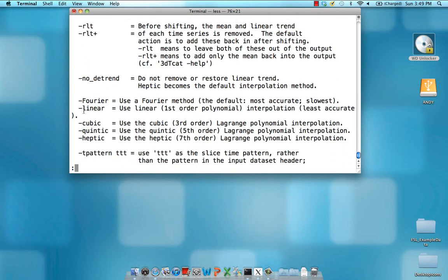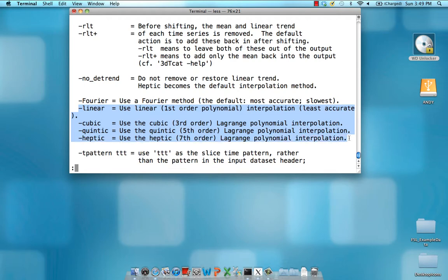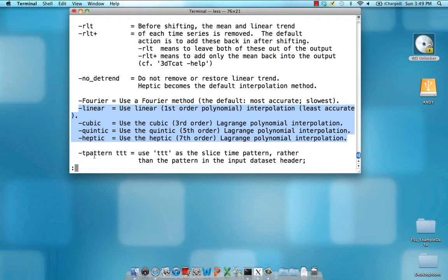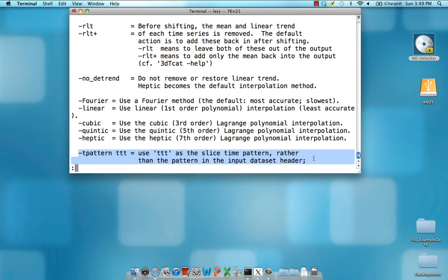Most important is this set of interpolation methods. Now, higher level interpolations, they're slower, but they give you a better approximation for the interpolated time course for each slice. And lastly, T-pattern allows you to specify the acquisition at which you acquired slices. So for example, was it sequential? Was it alternating every other slice? Was it ascending, descending, and so forth?